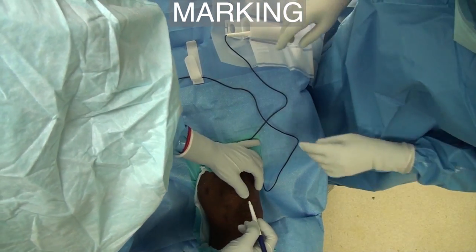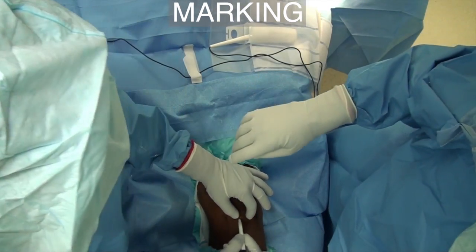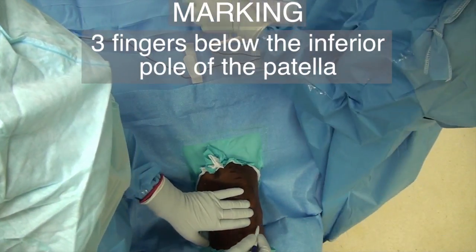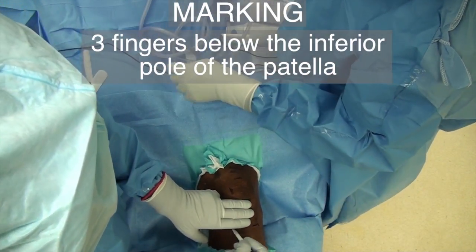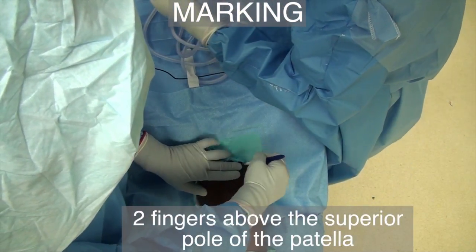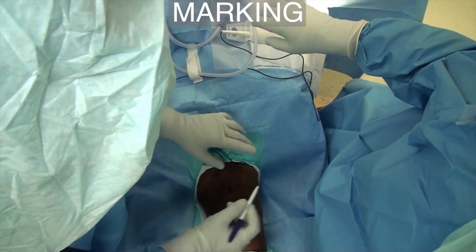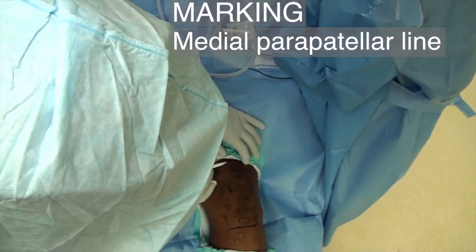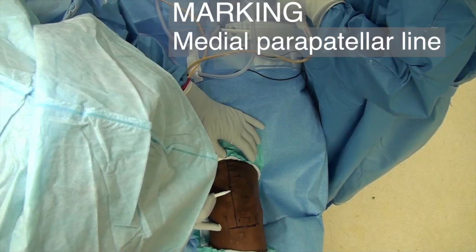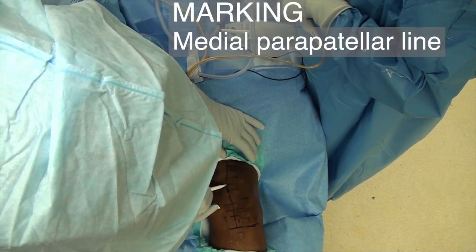Carefully mark the superior and inferior pole of the patella as well as the medial edge. Mark the point three fingers below the inferior pole of the patella — that will be your lower end of the incision. Mark the point two fingers above the superior pole of the patella — this will be the proximal end of your incision. Draw the incision line connecting the two points in the midline parapatellar line. Note that all the markings are done with the knee in extension.